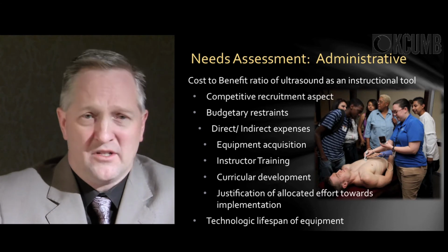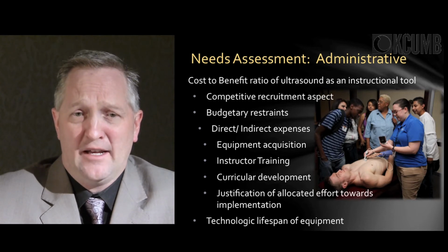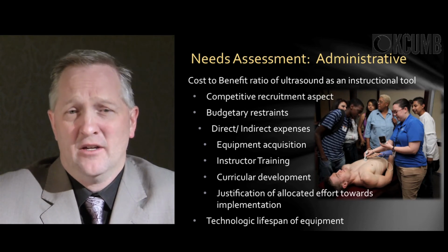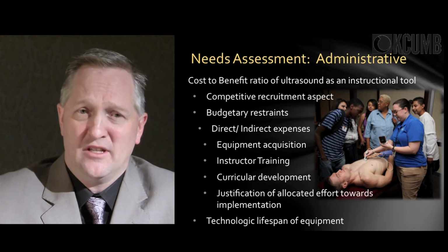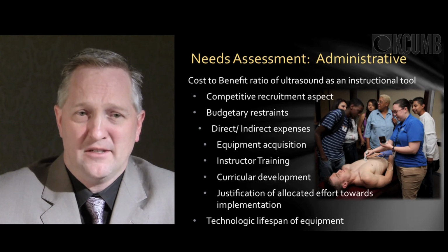Of course, there are some budgetary restraints. In the past, the units, the very large units, have run over $150,000. The newer handheld units, which we have been using, run between $7,000 and $8,000. So that dramatic change in the cost aspect has made it a more practical, applicable tool for us in laboratory and in educational opportunities.